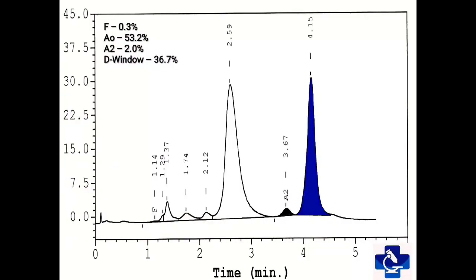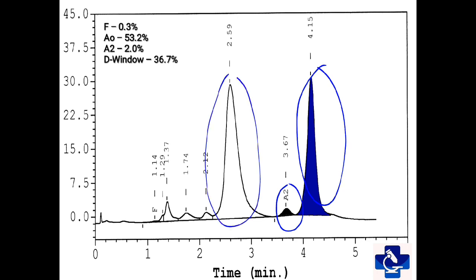In this graph, we can see that the D window has around 36.7% of hemoglobin fraction. A2 is normal at around 2.0% and A0 is around 53.2%, which is the predominant hemoglobin. Fetal hemoglobin is within normal limits. So this is the case of D Punjab or D Los Angeles heterozygous.